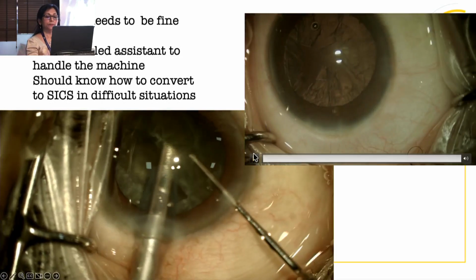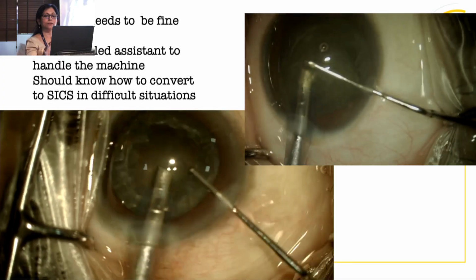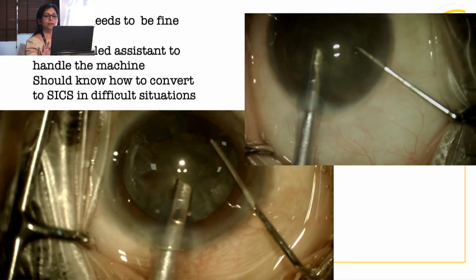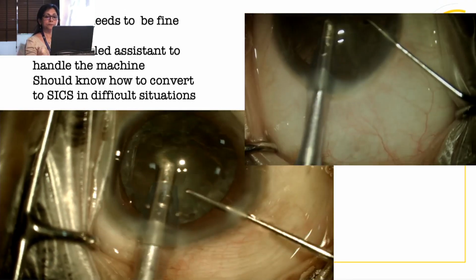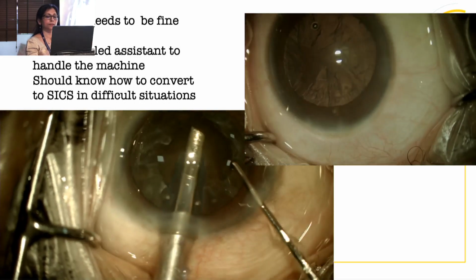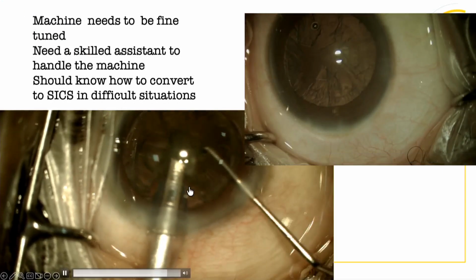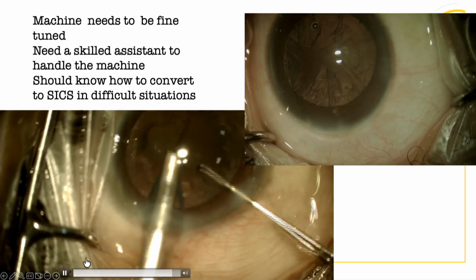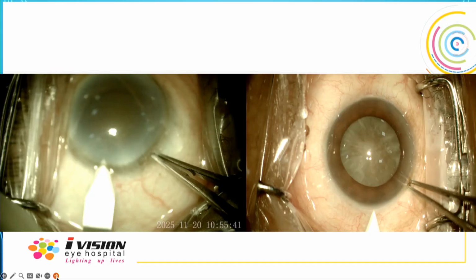Whereas this learning carouseling, this is a very, very good technique. You can see the phaco is finished in a minute. But you need some practice to do carouseling, and a good hydrodissection and multiple rotation of the nucleus is mandatory. Here I am still struggling with the soft cataract. So sometimes you end up with multiple problems.